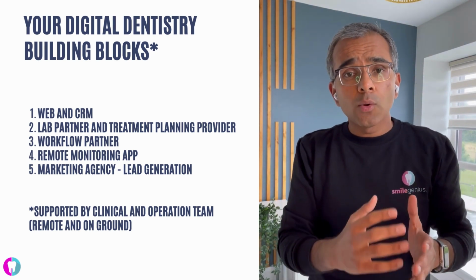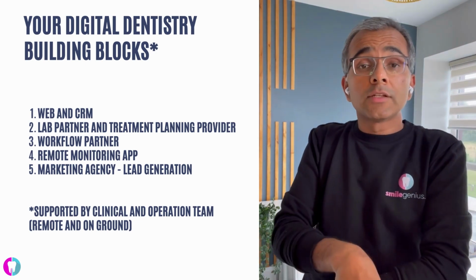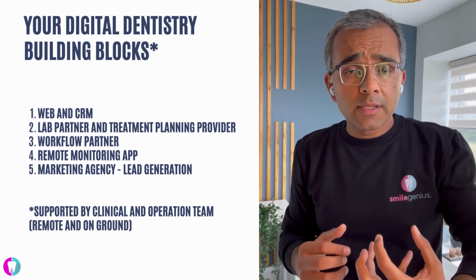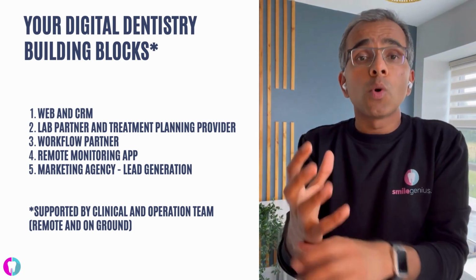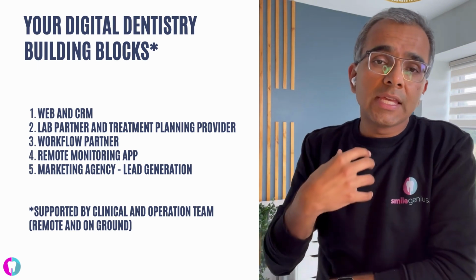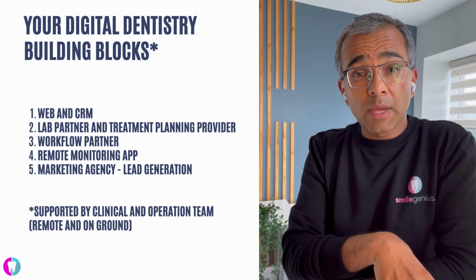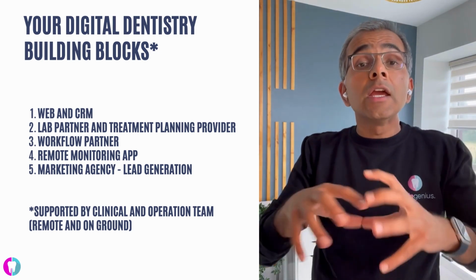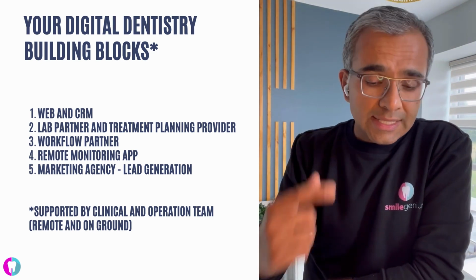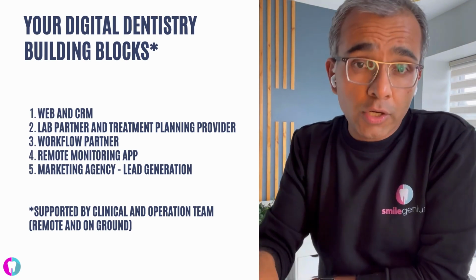Usually the labs will provide you, or your workflow partner could provide you with that. You will need a doctor's portal. So once you have captured the basic information about the patients, you will need a doctor's portal, or the dentist portal as they call it in UK and Ireland, to enhance the information about the patients, interact with the lab around that patient's information, have a single view of the patient's treatment, and remote monitor that patient at the same time as well. And once you've done that, you need to look for a remote monitoring platform.